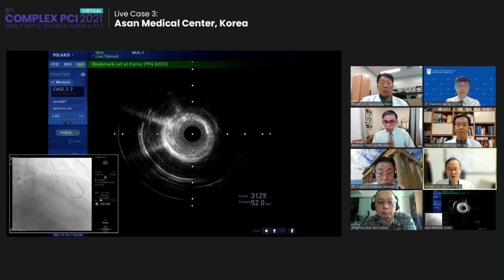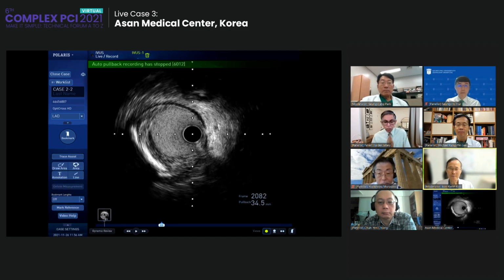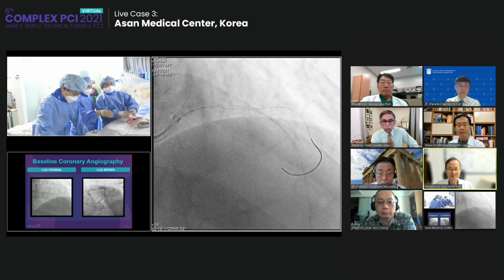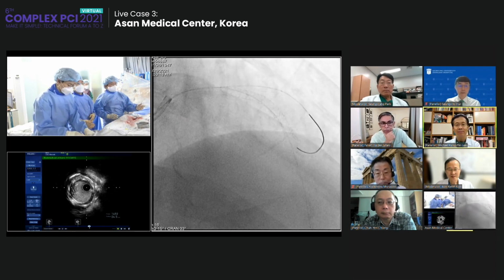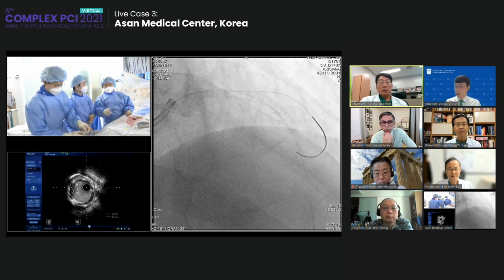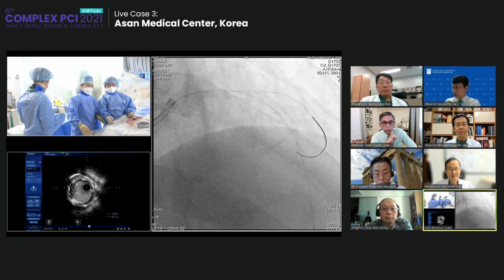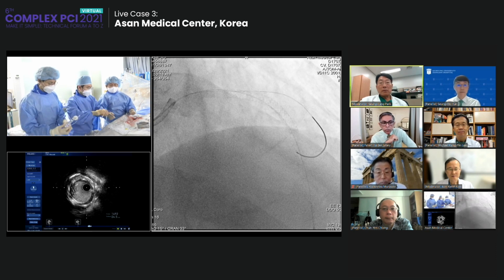There's a question from the audience about how old the LAD stent is. I think it's 8 years ago, right? How old is the stent? The previous one? Eight years ago we did the stent. 8 years ago, right. Wow.